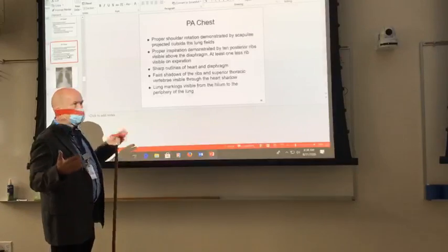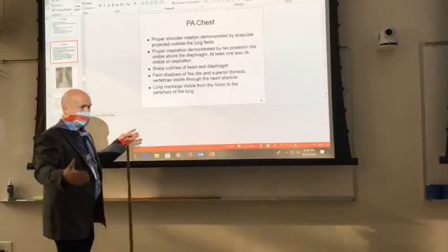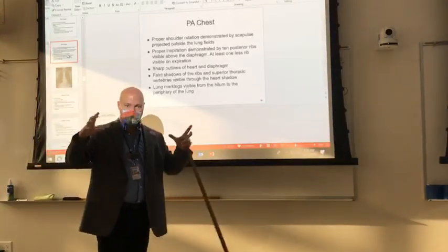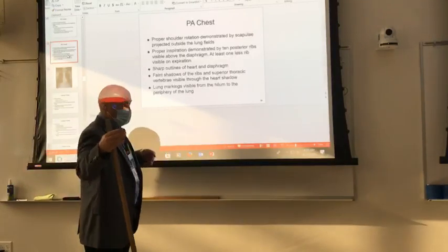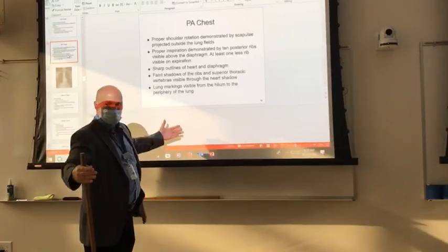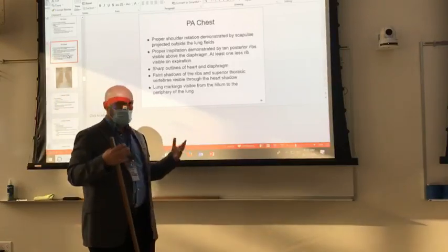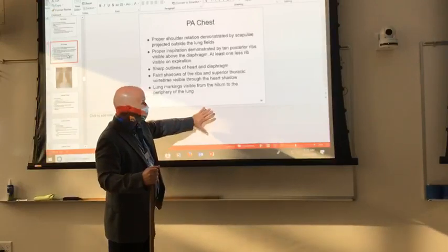We also shoot the chest x-ray at one of our two most common source to image receptor distances. The source is actually inside the x-ray tube, on that spinny thing, deep inside of the housing. So your SID, source to image receptor distance, is from that thing inside of the x-ray tube to the image receptor. So chest x-ray is 72 inches. That reduces magnification.